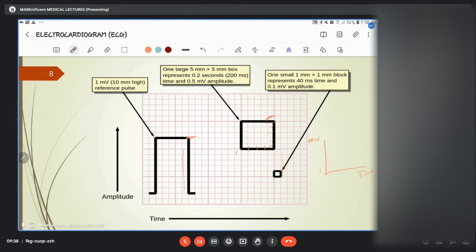And then in measurements, it is 1 millimeter. So this is for the small one. The big one, if you're just trying to estimate, is 0.2, 0.2, 0.2, and then 5 millimeters. And then for the 10 boxes, which is 2 of this here, 2 of this, which is what you have here, then it is 1 millivolt completely. So all of this aside, just a way of introduction, also trying to get you to understand these readings.